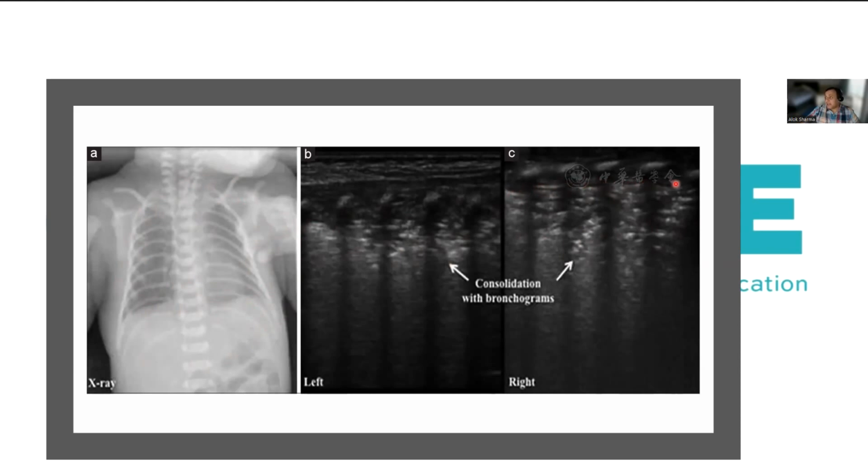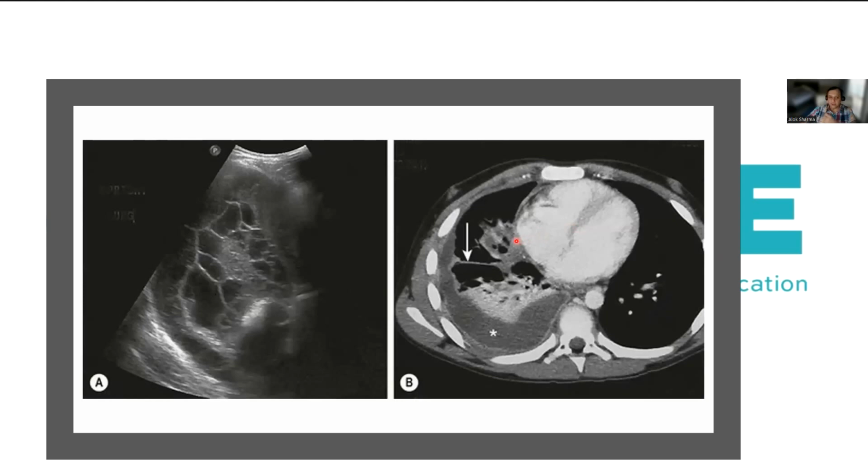Now, this is how sensitive lung ultrasound is, that you can see the smallest of effusions in this particular kind of view. But more importantly, the underlying lung pathology, which at this point is most probably severe respiratory distress syndrome if I correlate clinically, with atelectasis. Now, clearly from my perspective, this is a baby who doesn't need a therapeutic paracentesis. This baby needs intubation and surfactant, depending on the lung ultrasound scores. So again, lung ultrasound not only tells you the nature of the effusion, but also gives you a feel of the underlying lung pathology, which means that you can make therapeutic decisions.